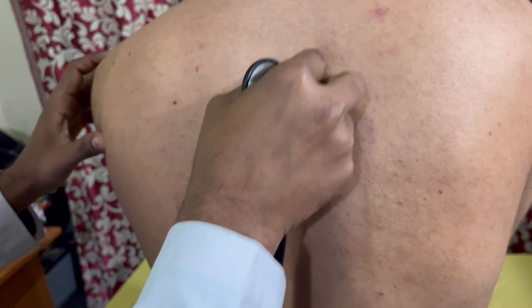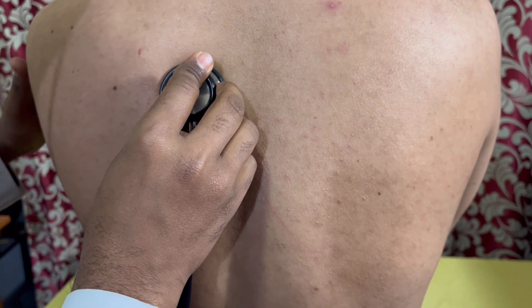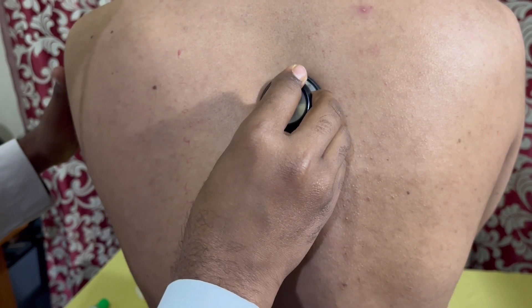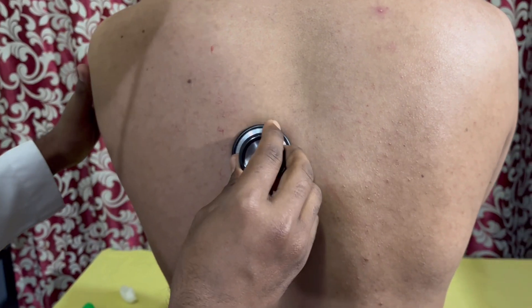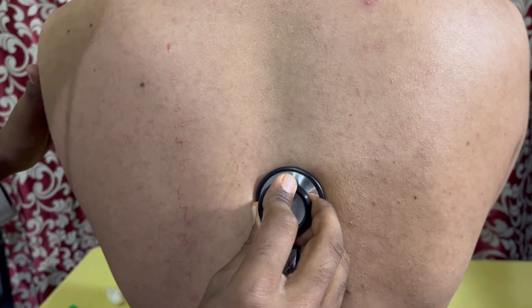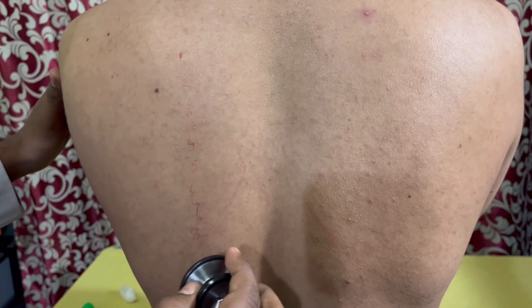After the suprascapular region, we auscultate along the interscapular space. First, the third and fourth intercostal space on the right side, then the left side. Then the fifth and sixth intercostal spaces, right side then left side. Then the seventh and eighth intercostal spaces.